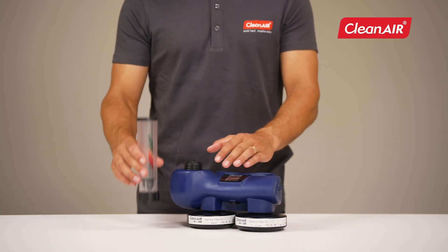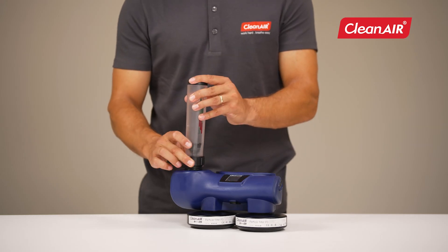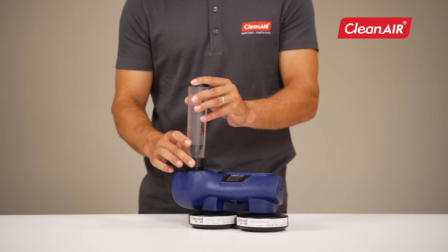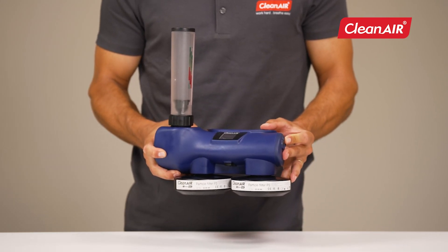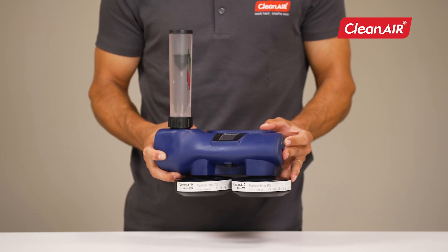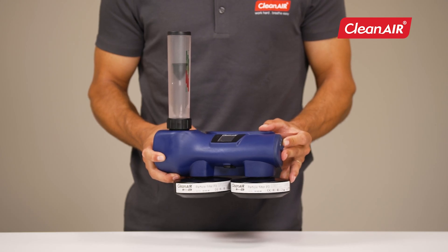Airflow meter. Screw the airflow meter onto the unit and switch it on. The flow rate is sufficient if the cone is in the green zone. If the cone is in the red area, try to replace the filters with new ones. If the airflow is still not sufficient, contact your service center.